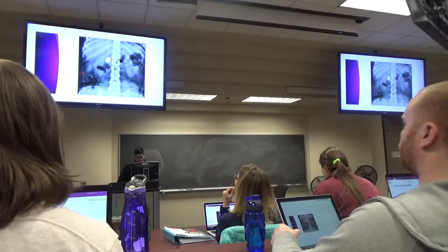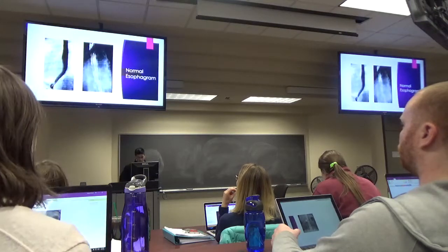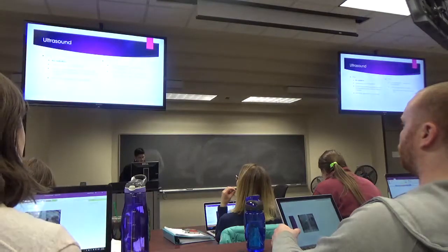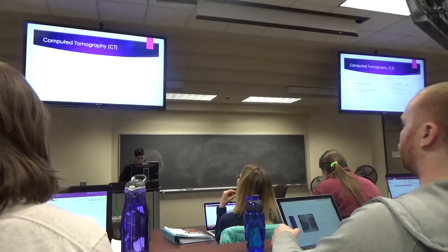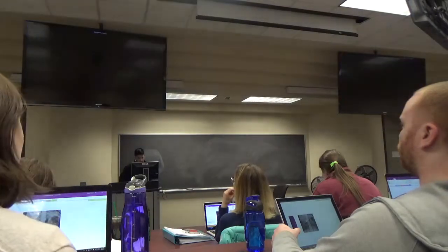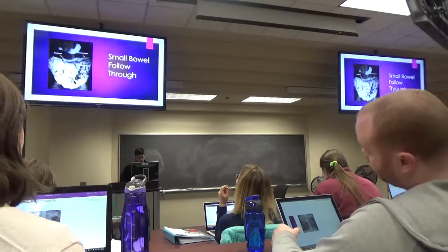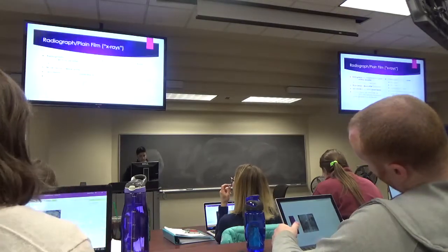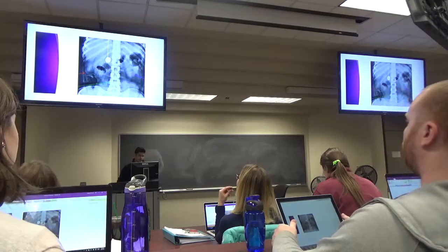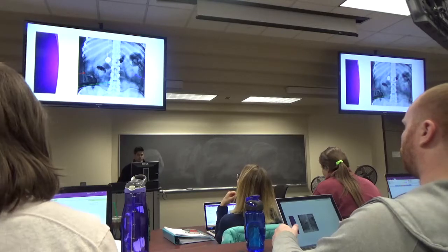Okay. So we have 5 different densities here. So here we have metal, and then another one is going to be bone that we talked about. I'm going from most dense to least dense.